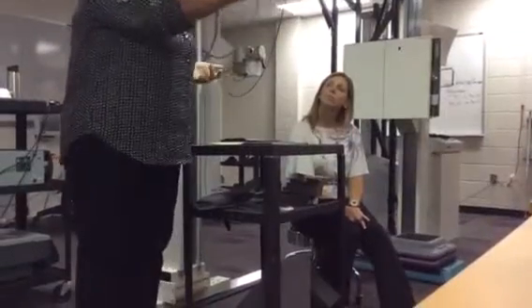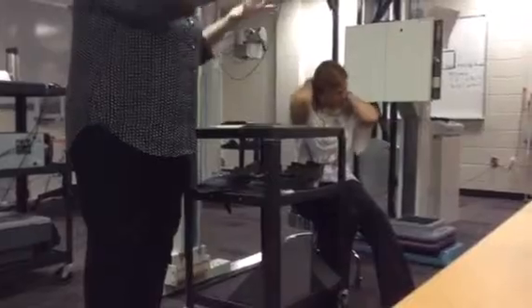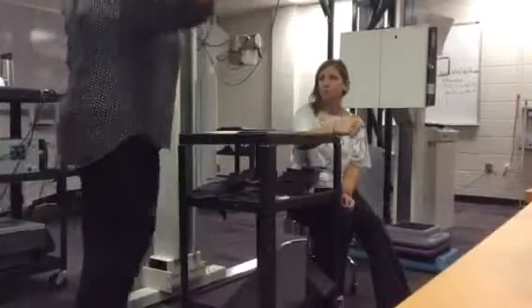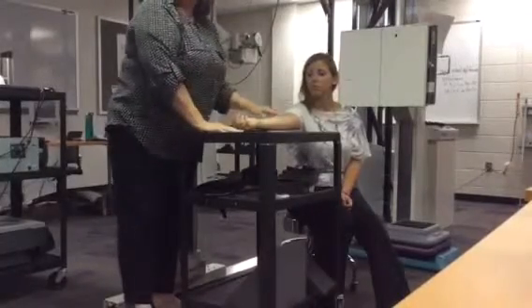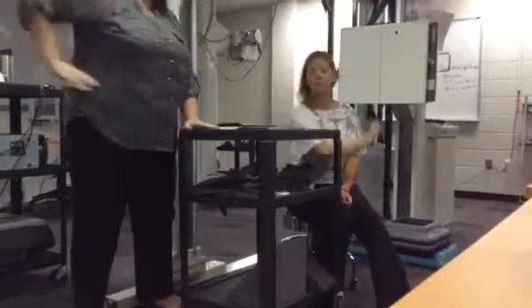When the patient's sitting in a chair, you have a built-in oblique. So when you're in this direction, it makes it a lot easier for the patient to hold that position. So put your arm like this. Now, one of the things you have to pay attention to is that the adult arm... hold on just a second, let me tell them this, you can get in a comfortable position.